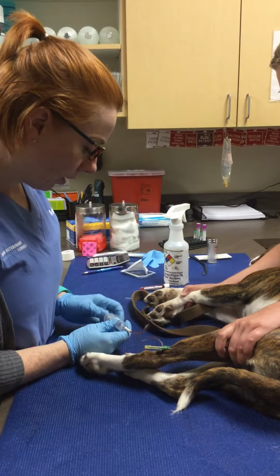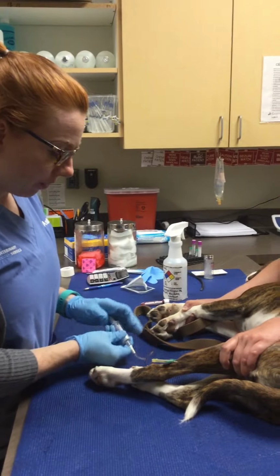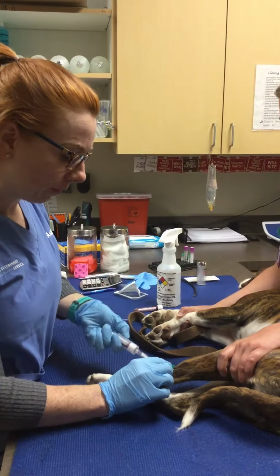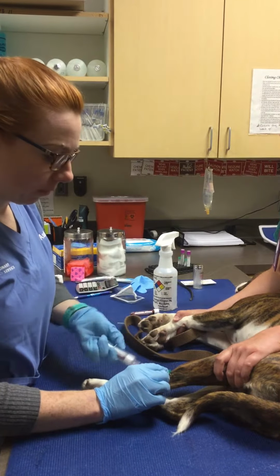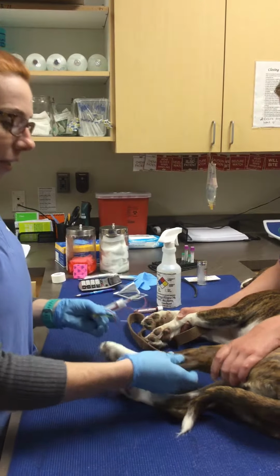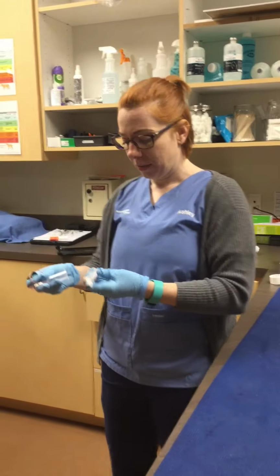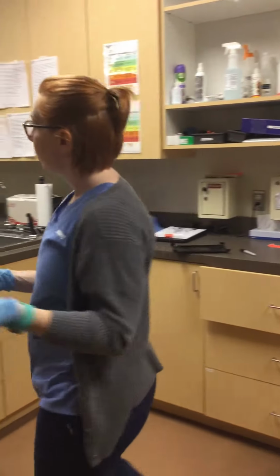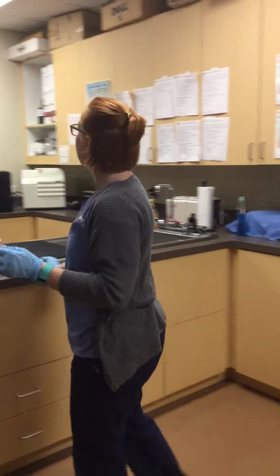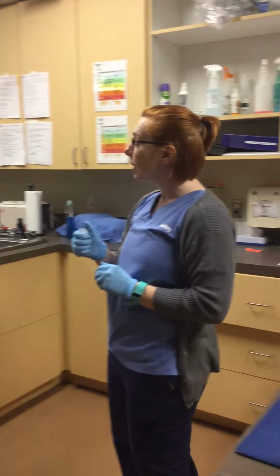Then I'm going to start timing for 30 seconds now while this tube fills up, and inverting it while I pull. And then now that I have at least 2 mLs, I'm going to pull out, and then she's going to hold it off. And I'm still counting for the 30 seconds while inverting. So 30 seconds, I don't have a clot yet, so I'm going to time it every 10 seconds.